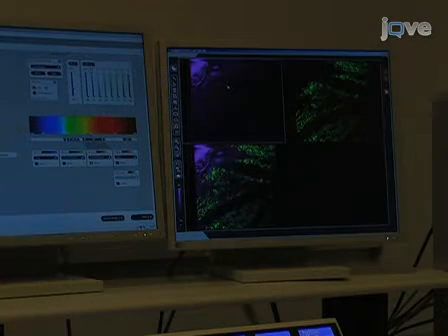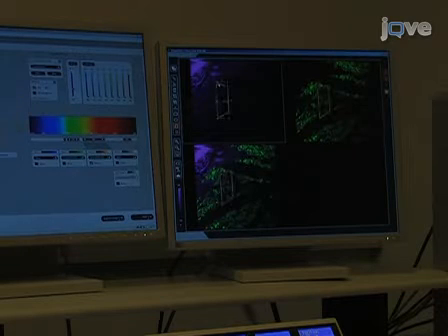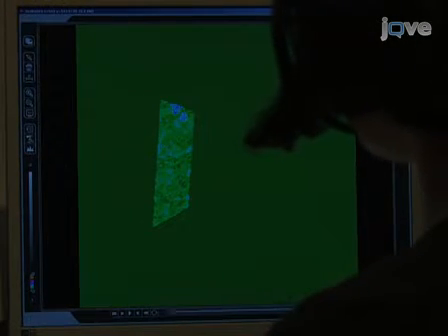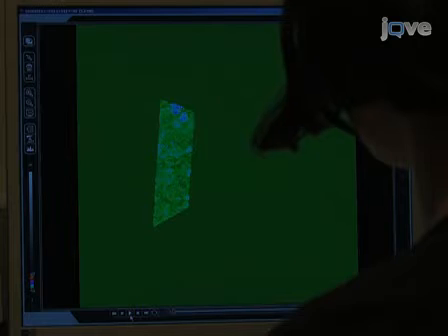Next, use the region of interest scan option to photoswitch a chosen population of cells with the 405 nanometer laser line. Collect emission from the red form of the protein in order to monitor the switching. Now collect post-switching 3D images by the same method that pre-switching images were collected. Right, so with the use of 20% laser power in the UV, we go to photoconvert this area.